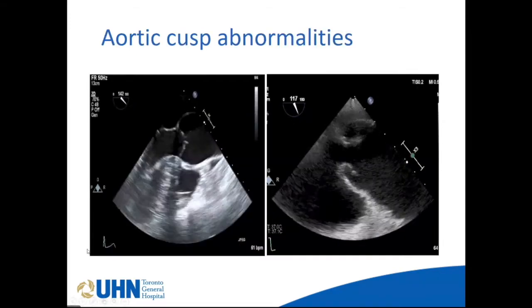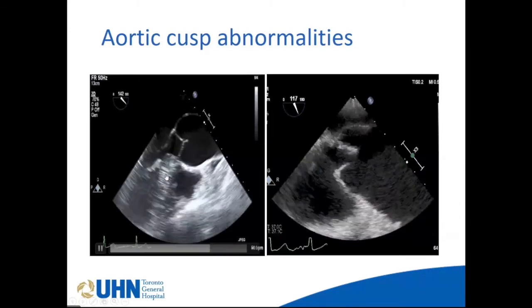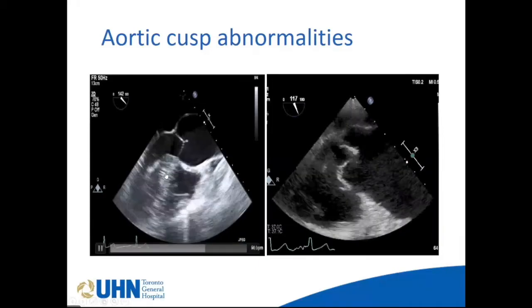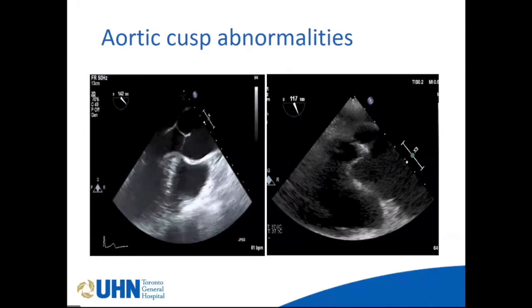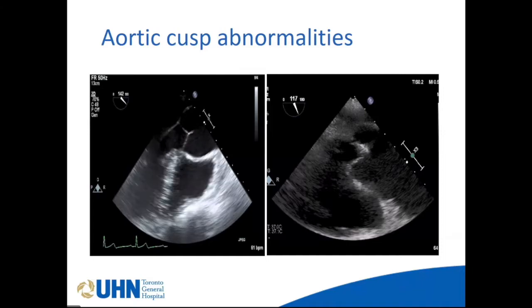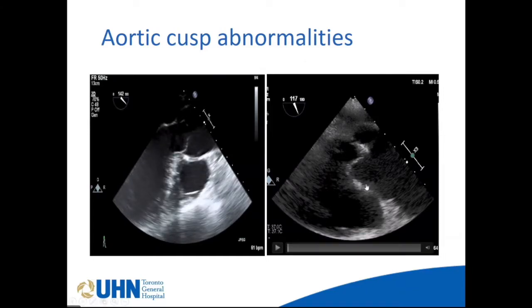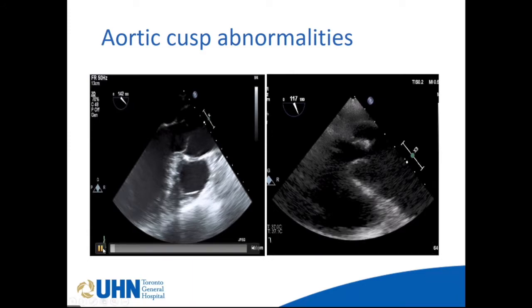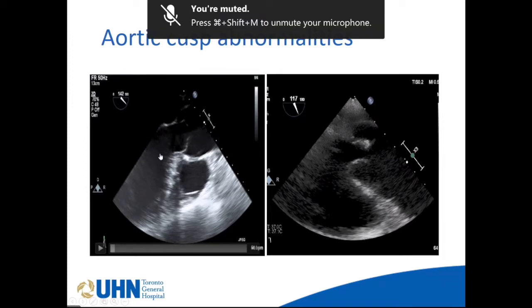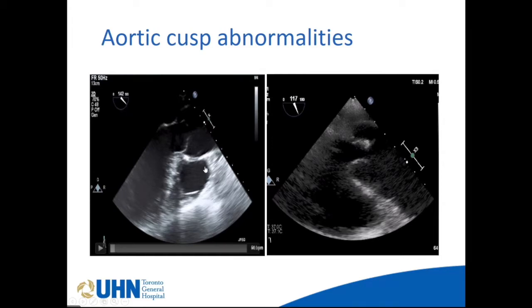Regarding aortic cusp abnormalities, the important things are absence of calcification and significant cusp prolapse, because these can restrict leaflet motion or cause eccentric regurgitation, adding complexity to the repair. Thickening and calcification — as seen in this image — make it very difficult to repair the valve; in such situations a Bentall procedure may be required. Look at this cusp — it's thin, coapting nicely, with minimal AI. This is a dream aortic root aneurysm that can be repaired with Dr. David's procedure.